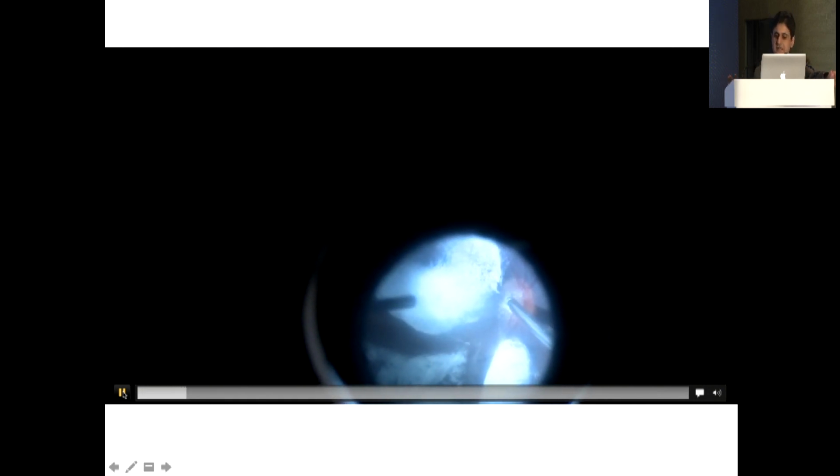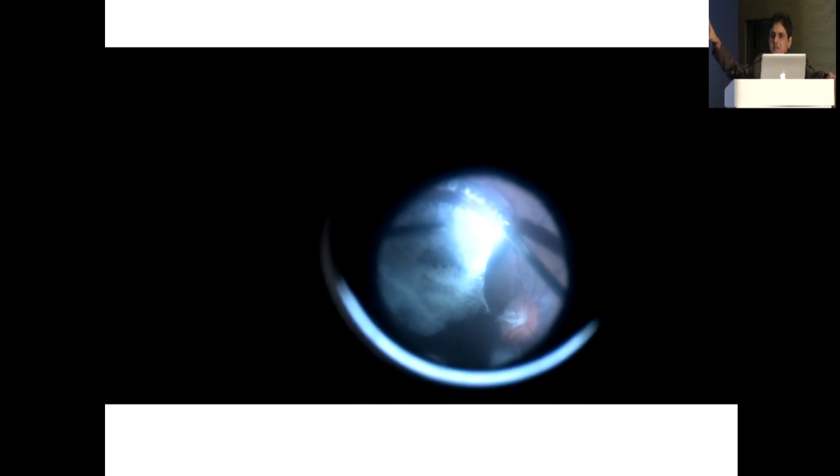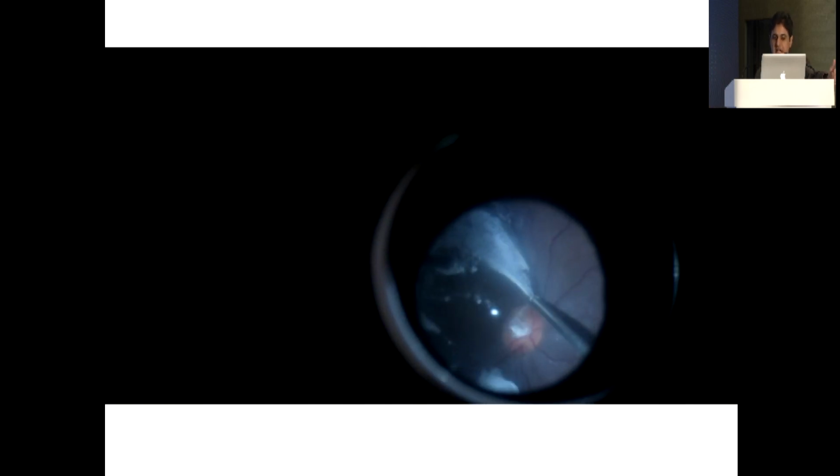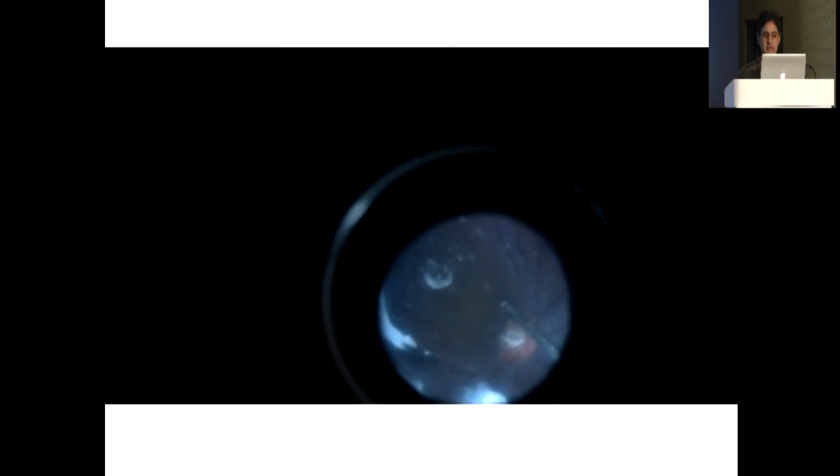So here is another video just highlighting the same thing. I'm just showing this in slow motion. You can see the main traction, and you can see this gliosis and fibrosis present at the temporal margin of the optic disc pit. So when I see this, I probably decide that I will not do much for this patient. I'll keep it simple. I will do just a PVD induction, a PPV, screening of the periphery, and injection of gas at the end of the surgery.